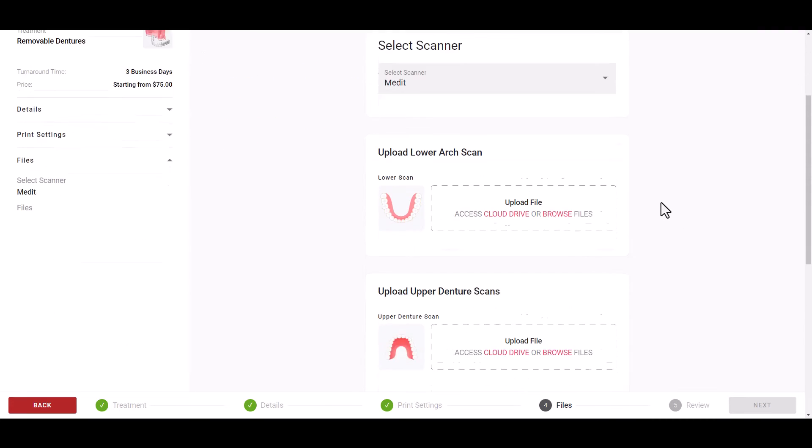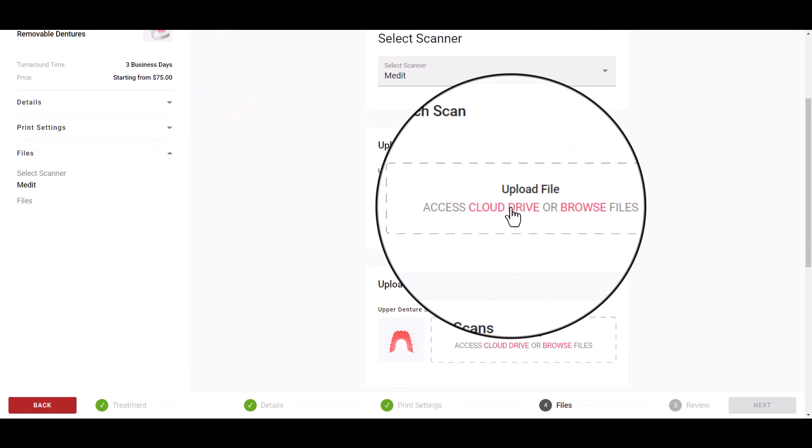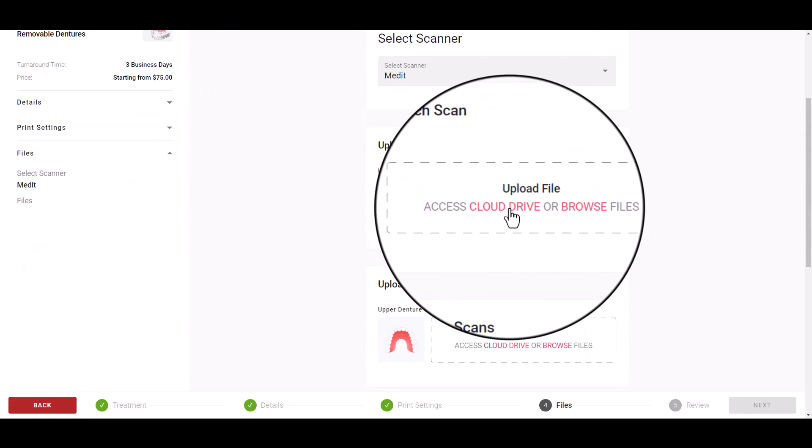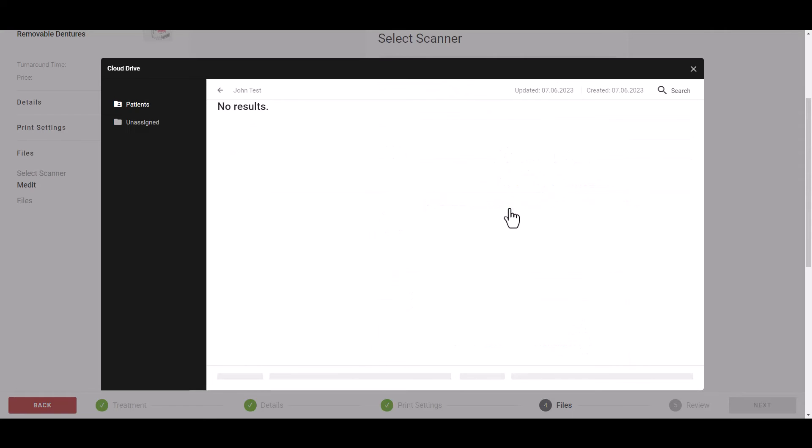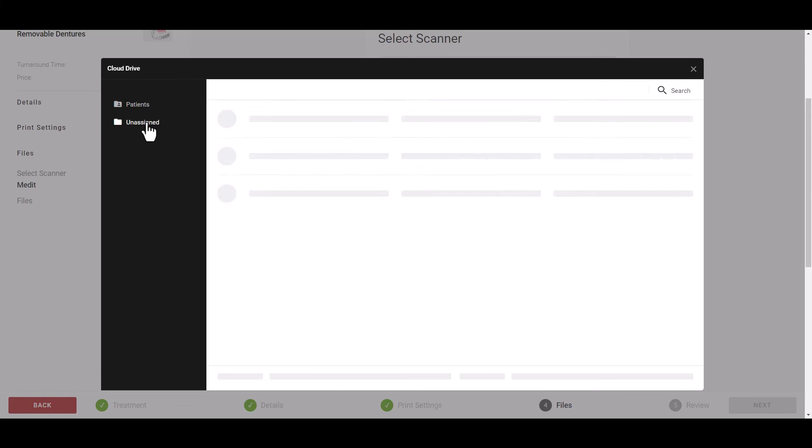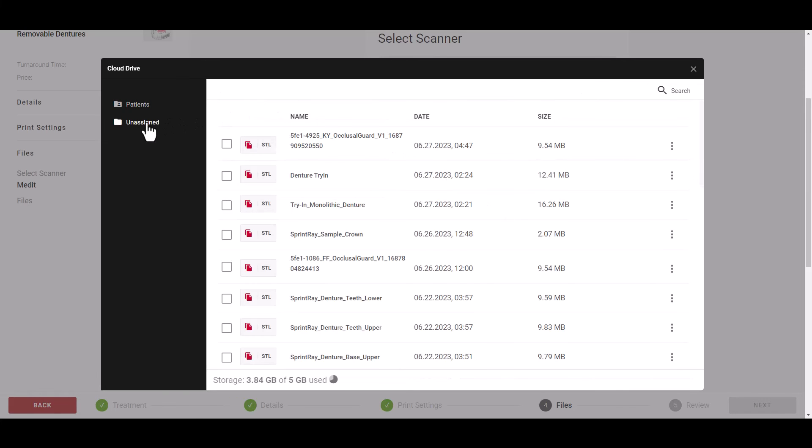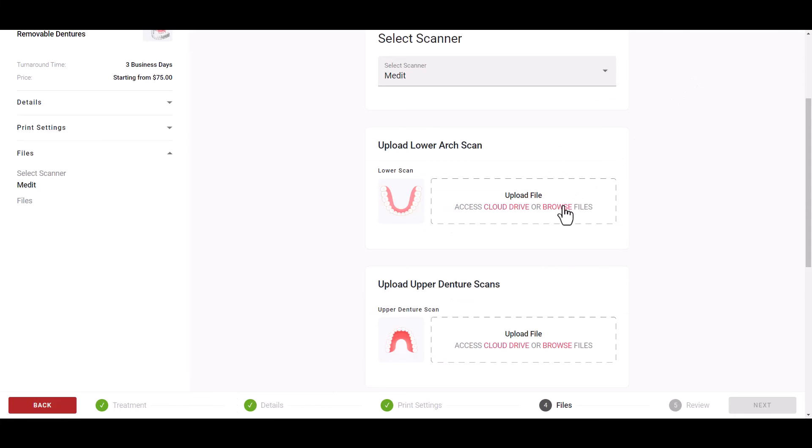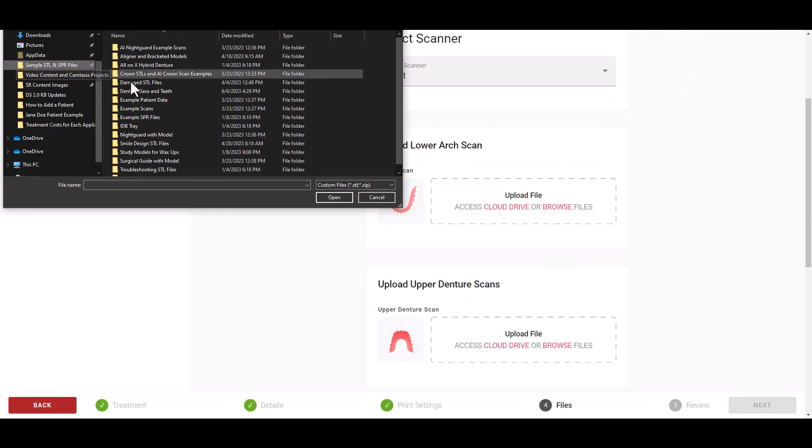SprintRay cloud design now offers integration with select intraoral scanners offering direct connection for intraoral scan data to SprintRay cloud drive, removing the need for you to manually upload your files to SprintRay cloud design.